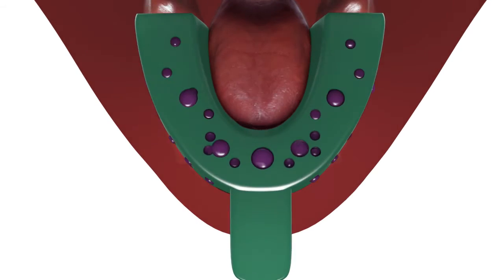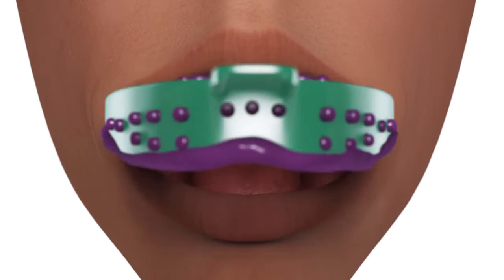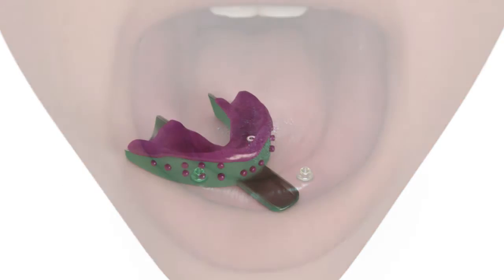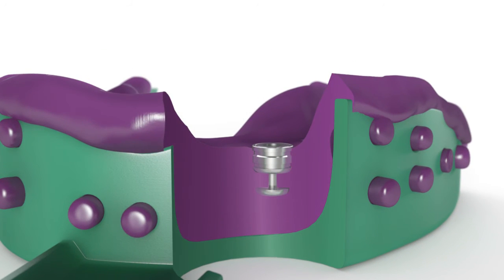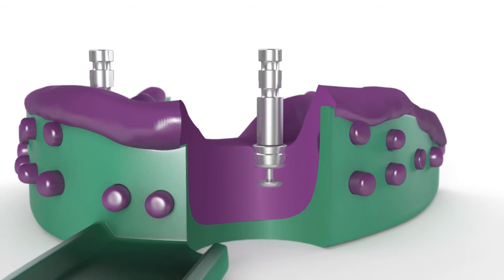Step 3: Once the impression material has set, remove the tray and the coping will be picked up in the impression. Step 4: Attach the OD Secure analog to the coping in the impression.